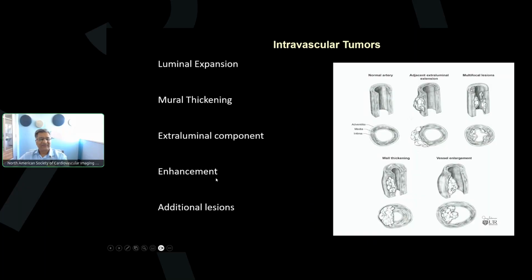And I think presence of enhancement is something that we can see if we have done multiphasic acquisition. Typically, this will be done on an MR, or sometimes you can also do a delayed enhancement. Iodine content on CT can also be useful.